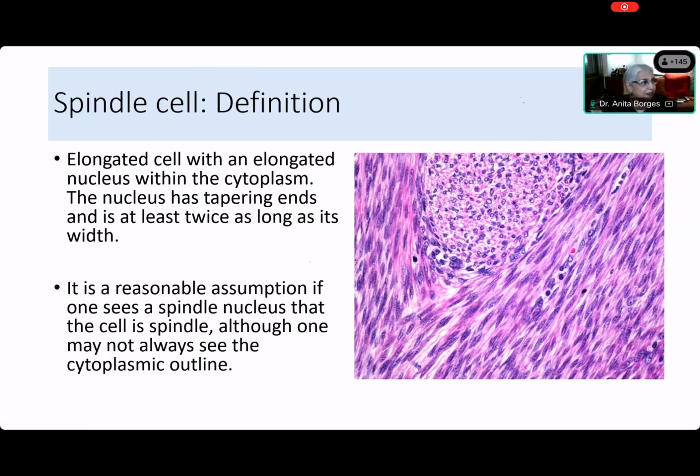Tell me what you're seeing in this slide. Just describe it. Do you see spindle cells in this slide? Yes, ma'am. I can see spindle cells. They are elongated cells. All right, you can see spindle cells in the slide. Do you see any other kinds of cells in the slide, Shashank? Yes, ma'am. I can see another type of cell. They make a separate boundary and they are oval to polygonal shape, ma'am.